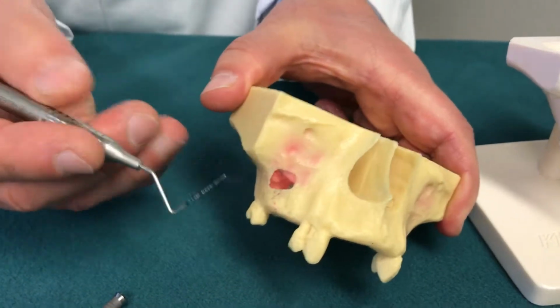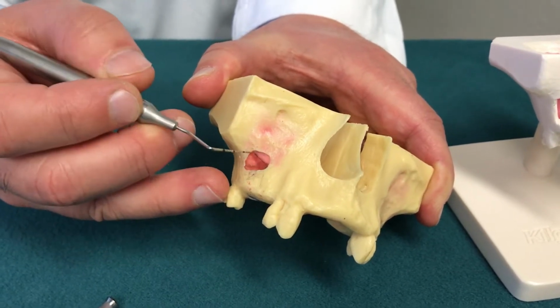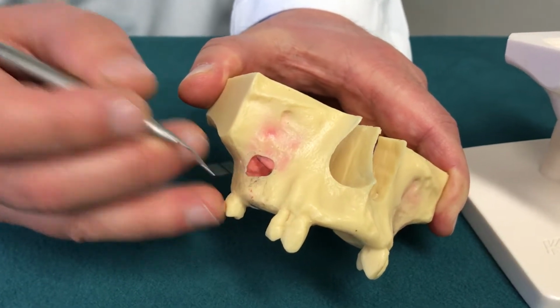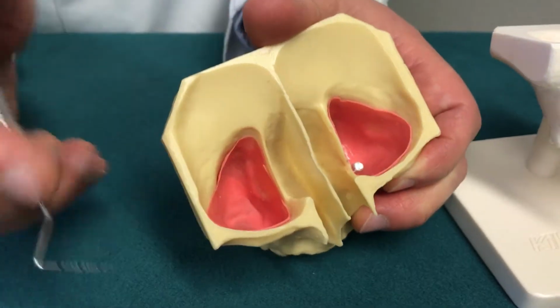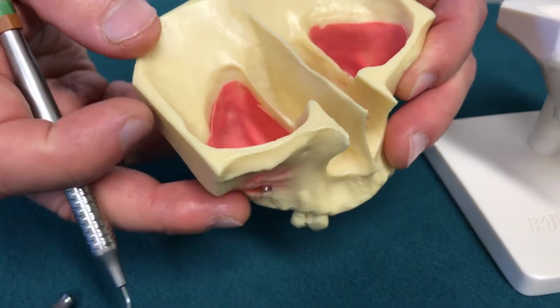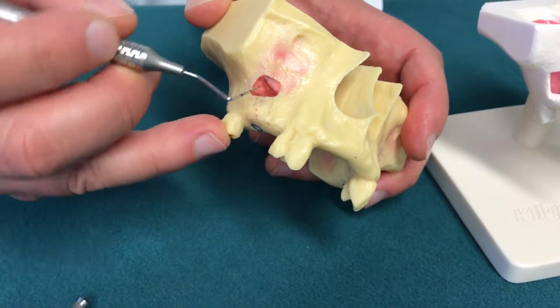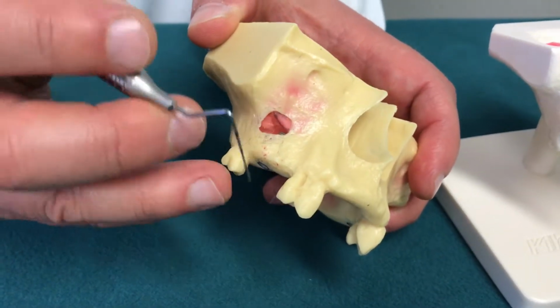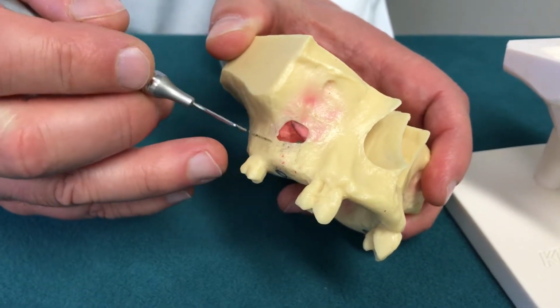So what we would do, in one procedure, we could come to the side of the jaw, take a little bit of bone out, and push the membrane in. There's a membrane called the Schneiderian membrane. This membrane is really thin, onion skin thick. We push that in, and then we place the implant, and then we pack this area with bone, and this area is going to be covered with the membrane here.